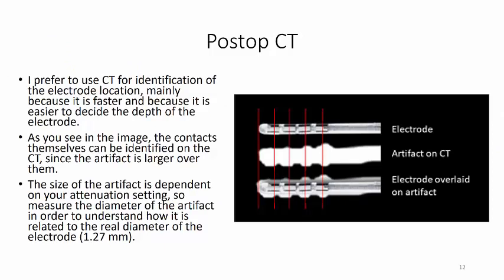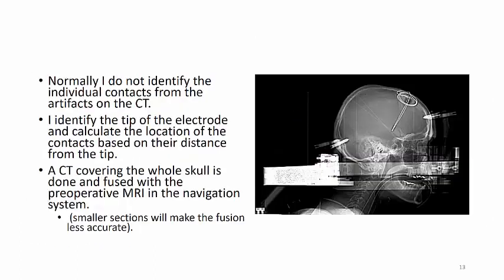Concerning postoperative CT, I prefer to use this for identification of the electrode location, mainly because it is faster and because it is easier to decide the depth of the electrode. As you see in the images here, the contacts themselves can be identified on the CT since the artifact is larger over them. The size of the artifact is dependent on your attenuation setting, so measure the diameter of the artifact in order to understand how it is related to the real diameter of the electrode. Normally, I do not identify the individual contacts from the artifacts on the CT. I identify the tip of the electrode and calculate the location of the contacts based on their distance from the tip. A CT covering the whole skull is done and fused with the preoperative MRI in the navigation system.